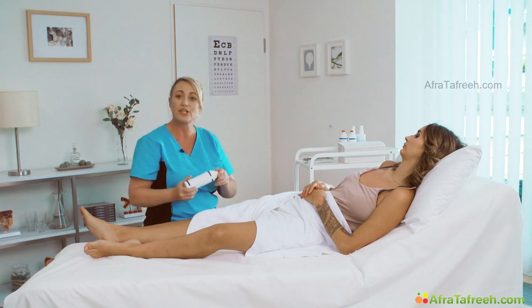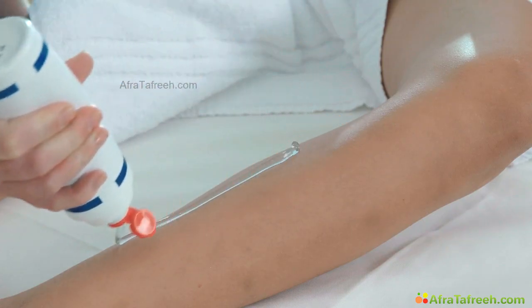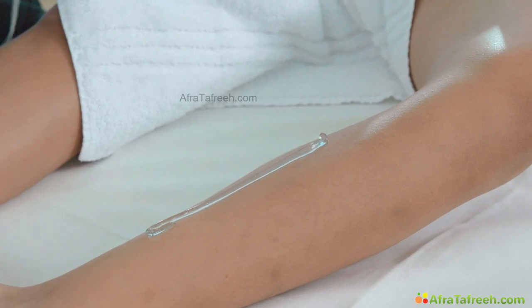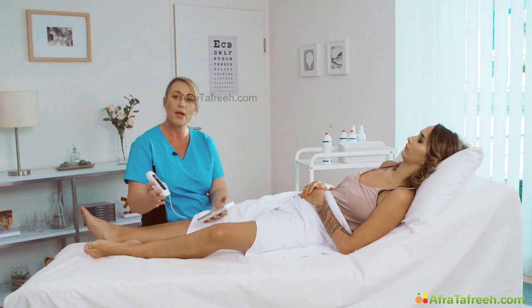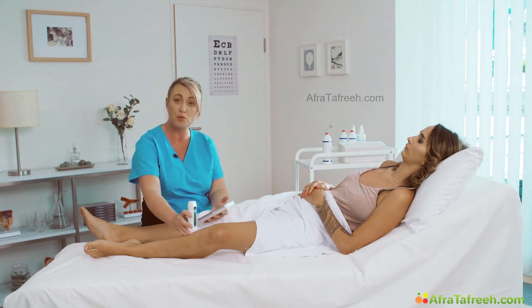So we'll place some jelly again on the lower leg, on the inside of the leg. Spreading the jelly from the proximal medial calf down to the ankle. We're going to place the transducer mid-calf in a transverse plane. I usually find it easier to find the veins at this position rather than more proximally, where the calf is a bigger diameter and the veins are deeper.